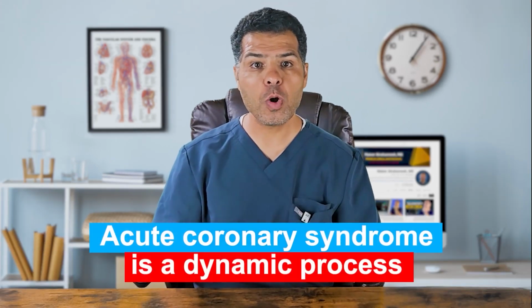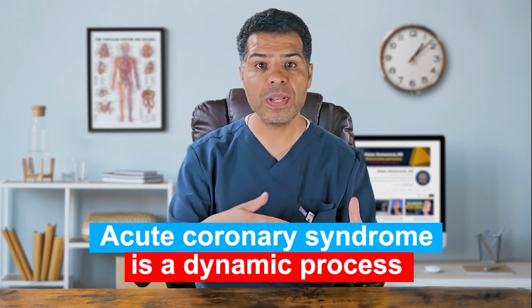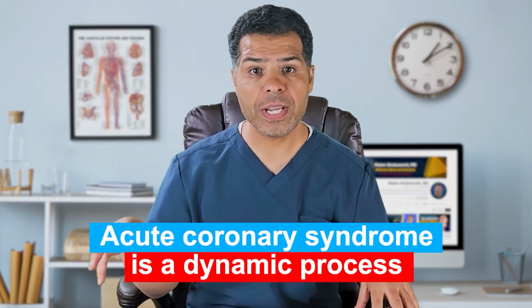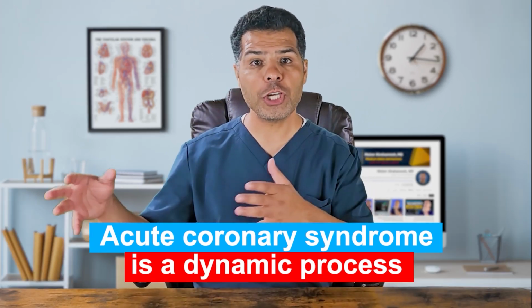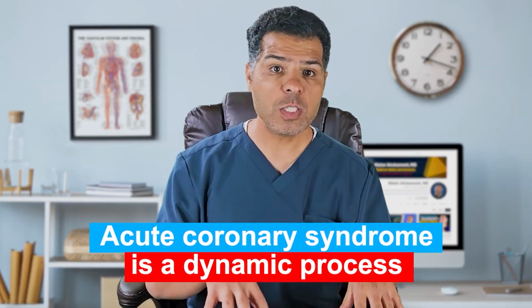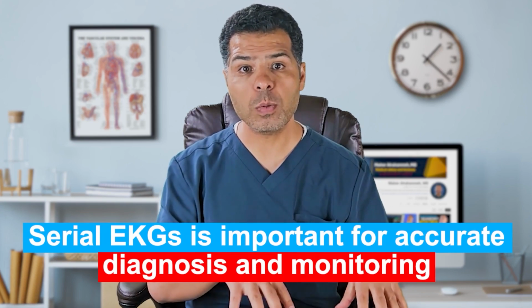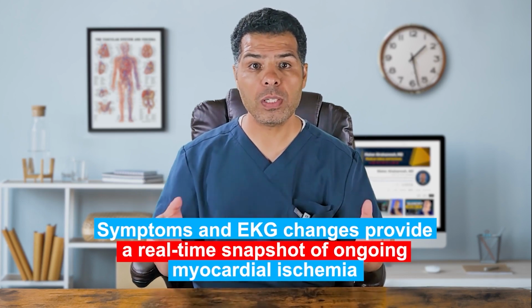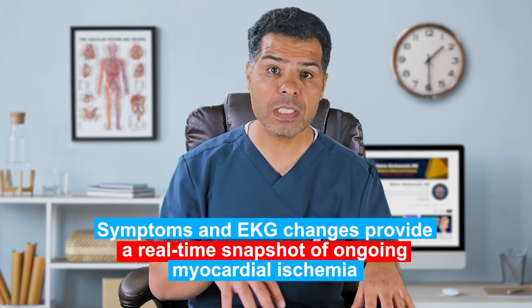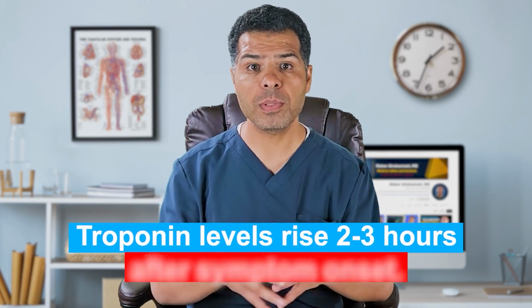Acute coronary syndrome is a dynamic process in which the coronary artery may spontaneously open and close. This causes alternating periods of symptoms and symptom-free intervals with corresponding changes, of course, on the EKG. This is why obtaining serial EKGs is important for accurate diagnosis and monitoring. Remember, symptoms and EKG changes provide a real-time snapshot of ongoing myocardial ischemia, while troponin levels may initially be negative as they typically rise 2 to 3 hours after symptom onset.